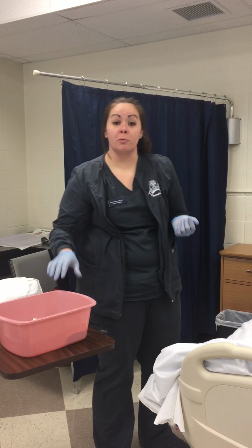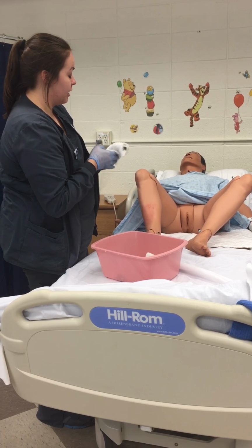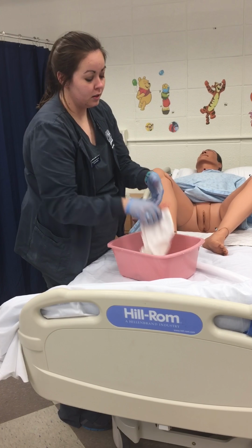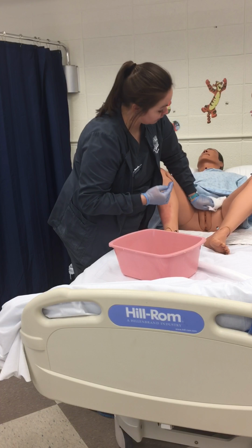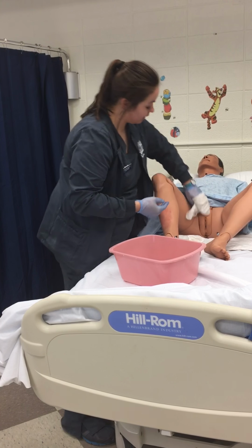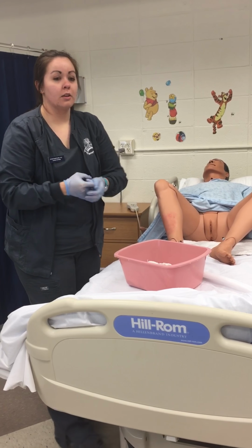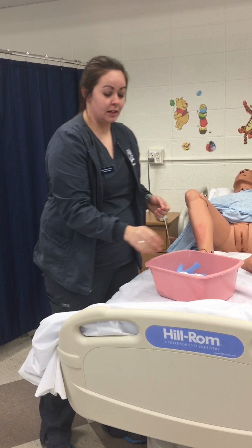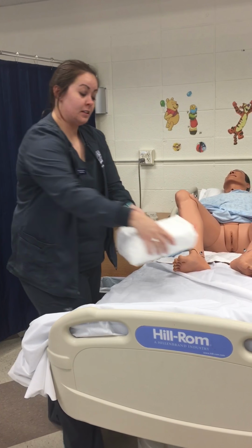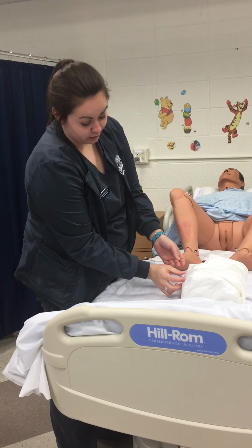And begin by performing pericare on my patient. So first, with a wet washcloth, I would wipe from front to back. And again, from front to back. And then on the other side, I would wipe from front to back. Once that is done, I would discard my supplies. Get my Foley tray and begin my procedure.